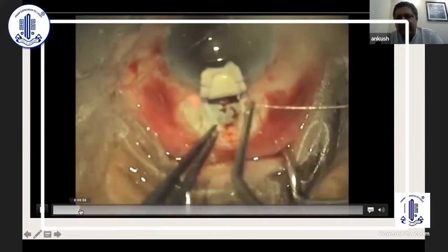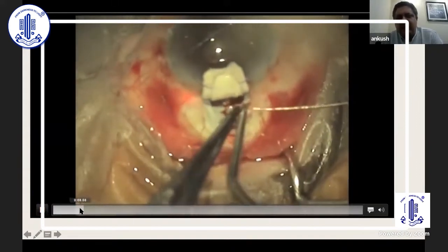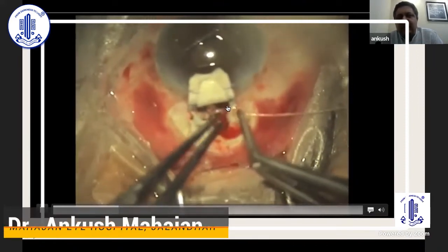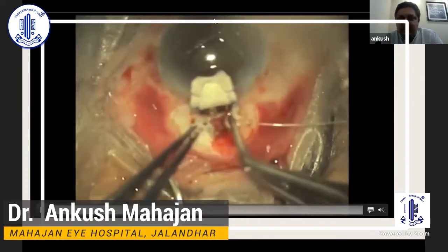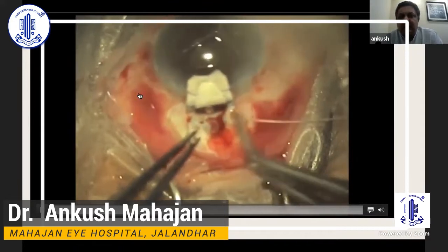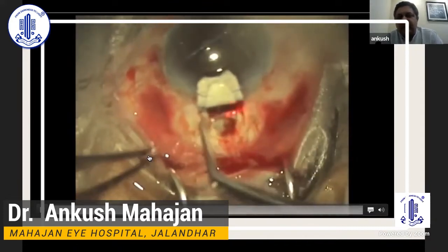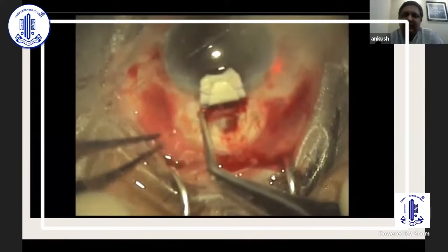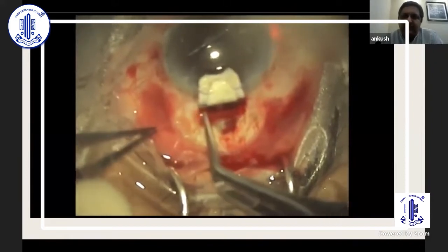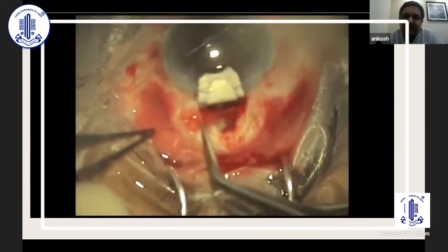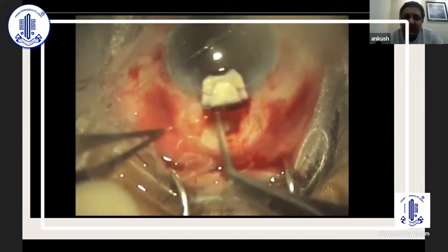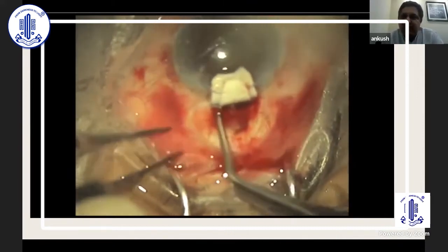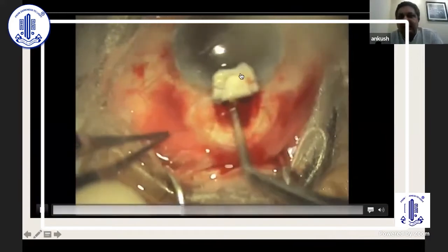In this case, everything was done. I put the catheter in the canal to cannulate it. What happened was the catheter got stuck somewhere at 6 o'clock. I thought, okay, if it got stuck at 6 o'clock we'll go from the other side. This happens sometimes because the Schlemm's canal develops kinks inside it. If you go from the other side, the catheter is sometimes able to navigate those kinks and come out. But that was not happening in this case.